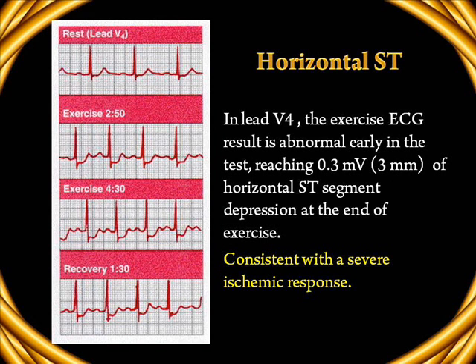Let us look at these ECG recordings. In the resting state in the lead V4, we don't have any ST segment changes. ST segment is in the baseline. At an exercise of 2 minutes 50 seconds, patient started showing ST segment depressions which are horizontal in nature. By 4 minutes 30 seconds, the depressions have become much more marked and these persisted into a recovery phase up to 1.5 minutes. Such a ST segment depression of horizontal nature persisting into the recovery phase, increasing with the increasing duration of exercise, is consistent with severe ischemic response.